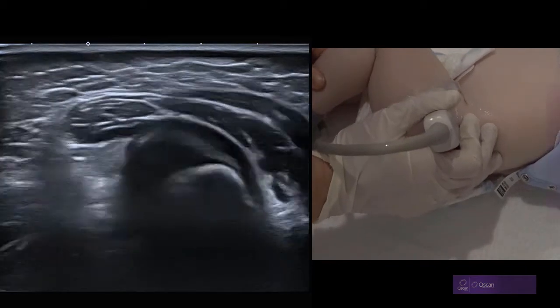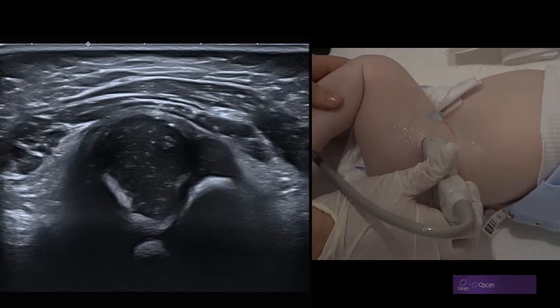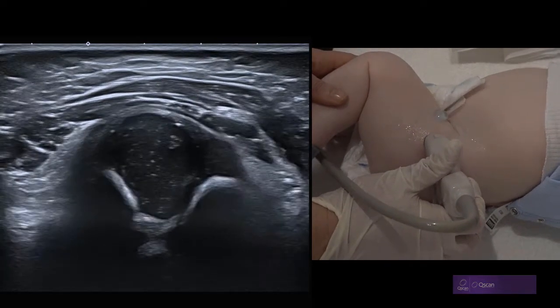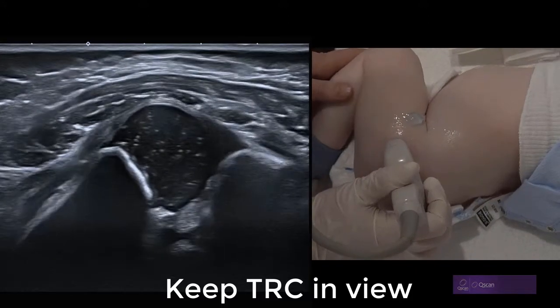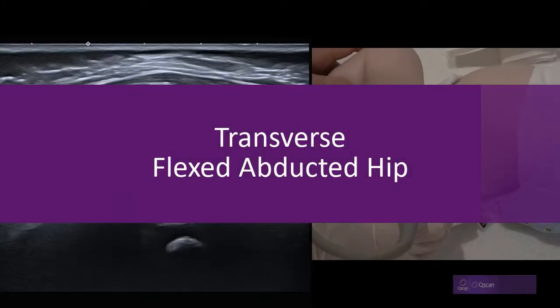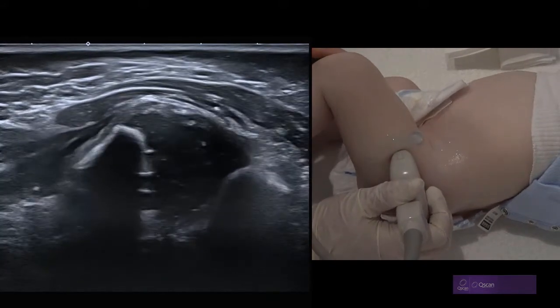The second view is a transverse flexed hip. We now see the femoral metaphysis or shaft on the left and the ischium on the right. We then add abduction to widen and deepen the acetabulum, which should pull any dislocated head back into its socket.